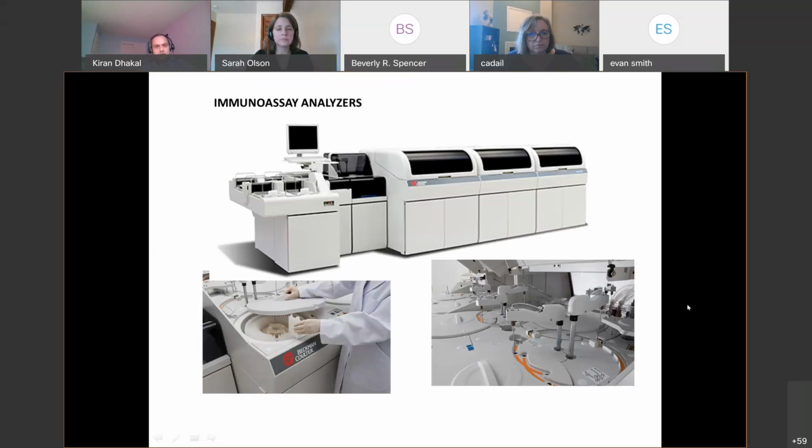A big instrument, you can put reagent in one side of the instrument, and it has a lot of robotic handles. It can walk through the sample reagent and then sample the urine specimen, mix together, and then pass to the spectrophotometer to give the final result.